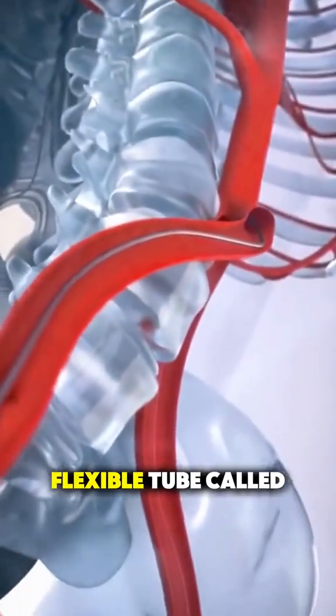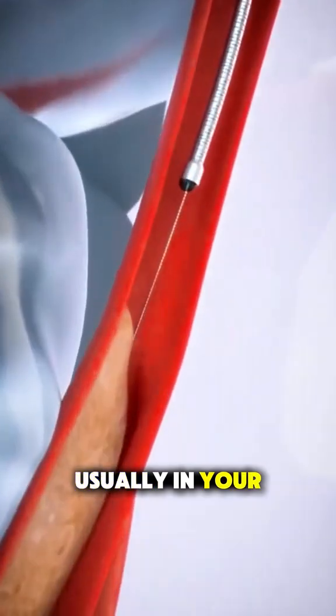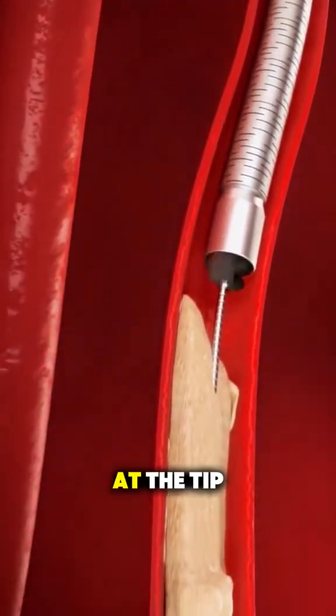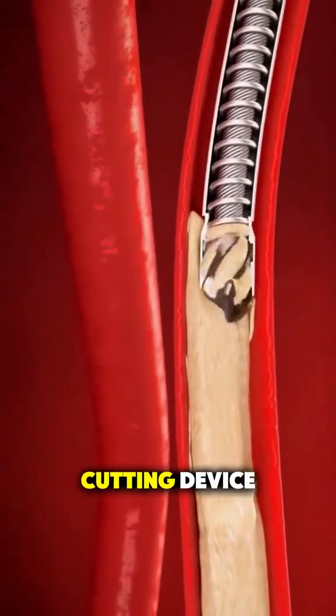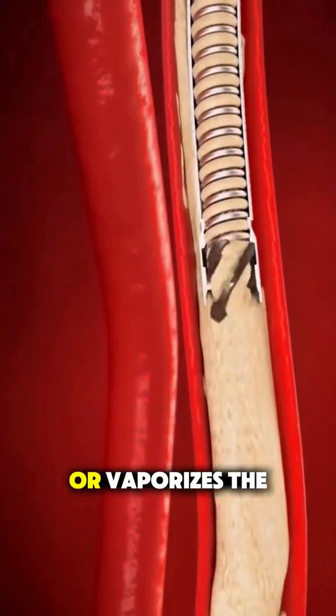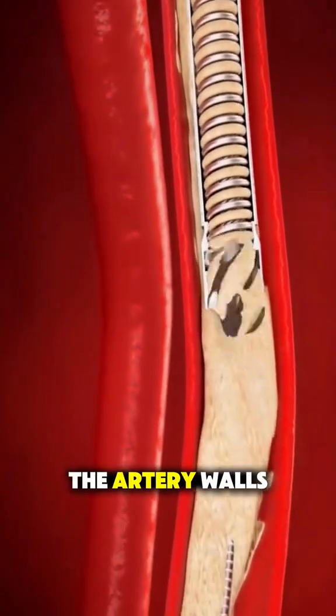In an atherectomy, the doctor inserts a thin, flexible tube called a catheter into a blood vessel, usually in your groin or arm, and guides it to the blocked area. At the tip of the catheter is a tiny cutting device, laser, or spinning blade that carefully shaves or vaporizes the plaque away from the artery walls.